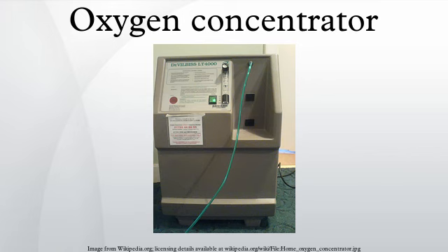Applications: PSA generators provide a cost-efficient source of oxygen. They are a safer, less expensive, and more convenient alternative to tanks of cryogenic oxygen or pressurized cylinders. They can be used in various industries including medical, pharmaceutical production, water treatment and glass manufacture. PSA generators are particularly useful in remote or inaccessible parts of the world or mobile medical facilities.